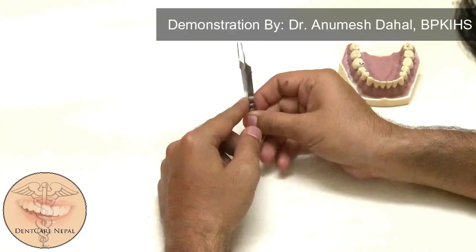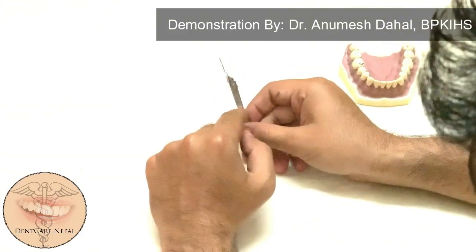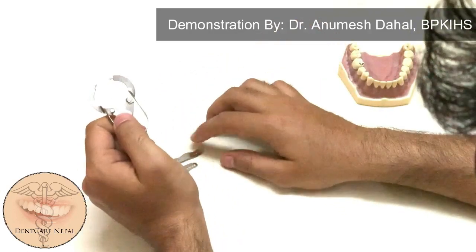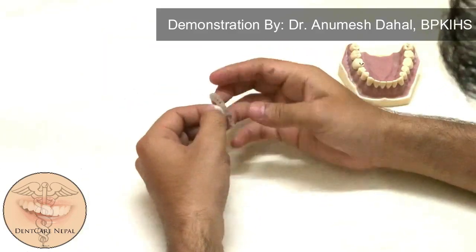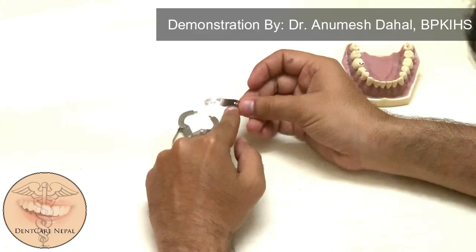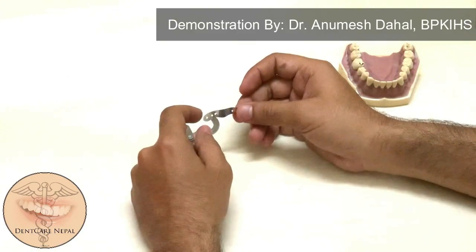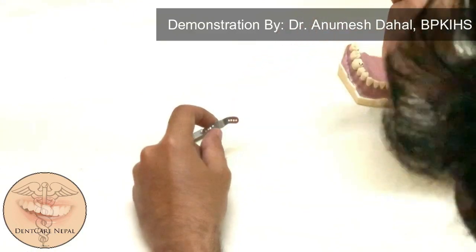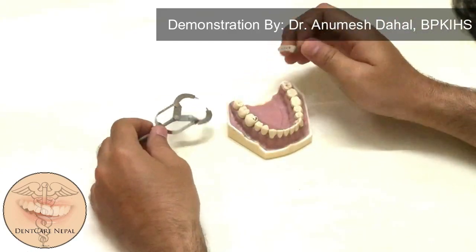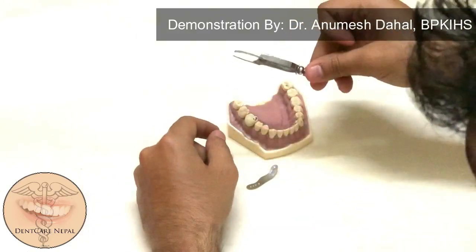When you view the band from the side, it is not very straight — it has a special shape so that the band can adapt to the tooth as closely as possible. There is a curvature which swabs inward at the gingival margin, which will fit easily into the proximal area of the proximal cavity.